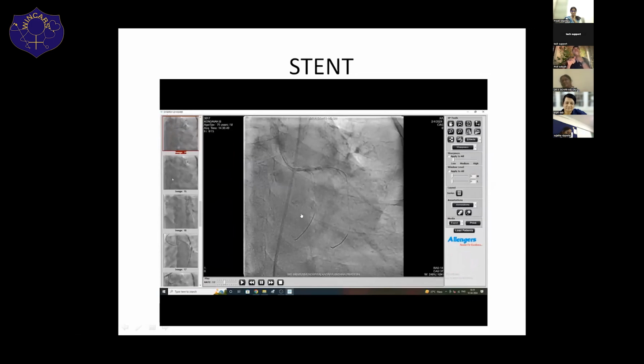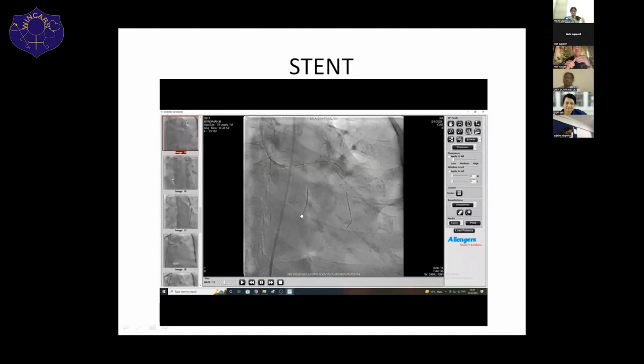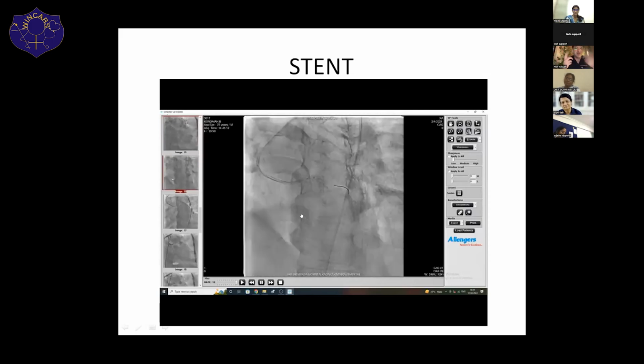If you see, slightly deeper, the patient had a calcium nodule. So if we go by pathology, a calcium nodule causing ACS is around 5 to 10%, and that too an eruptive calcified nodule.